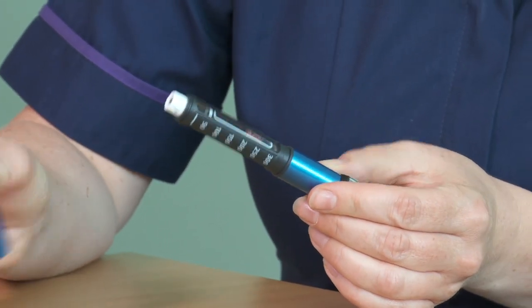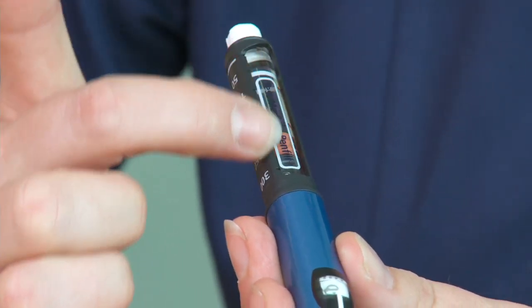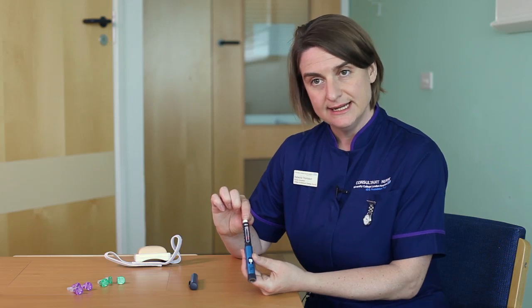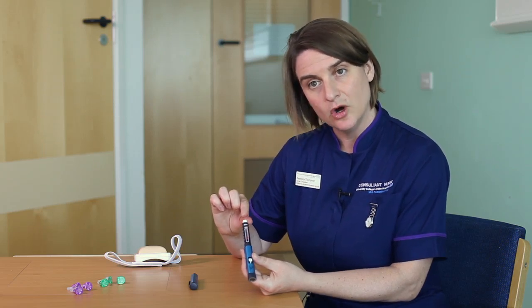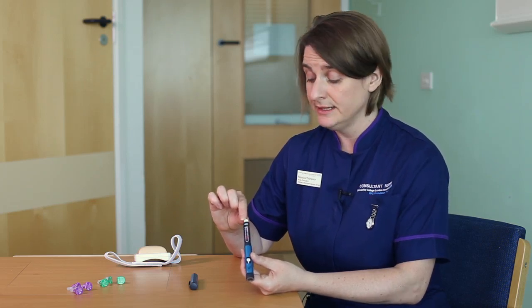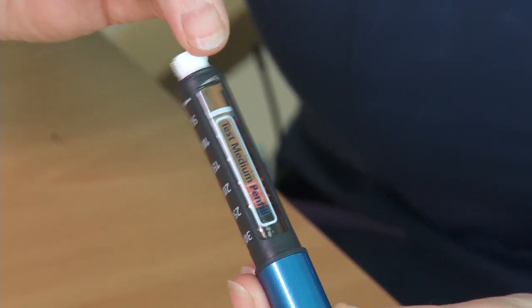When you take the lid off the pen you can see that this pen is refillable with insulin already inside the pen. Each insulin has a different colour on the top of the pen so that you can always recognise whether you've got the right insulin. This is a demo pen so it's white, but your pen will have a colour.